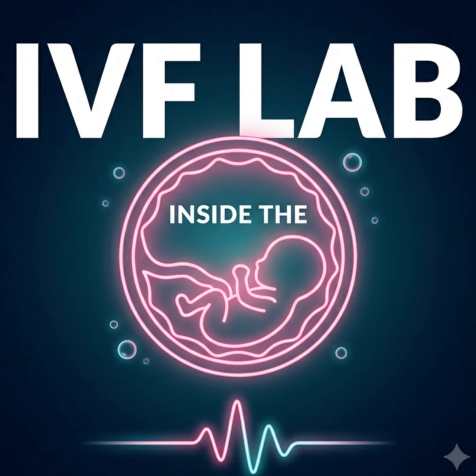If you blindly apply the Tokyo-trained AI to the Denver embryos, the algorithm might flag completely normal, healthy development as abnormal or slow, simply because the timing doesn't perfectly match its rigid training data. The AI doesn't know about barometric pressure or culture media brands. It only knows what it was taught. Wow. So an AI model is only as good and only as accurate as the specific environment it was trained in. It is not generating a universal biological truth.